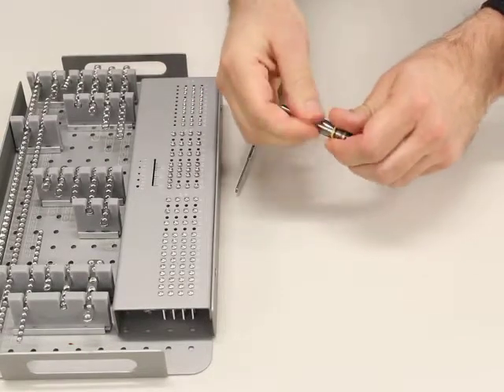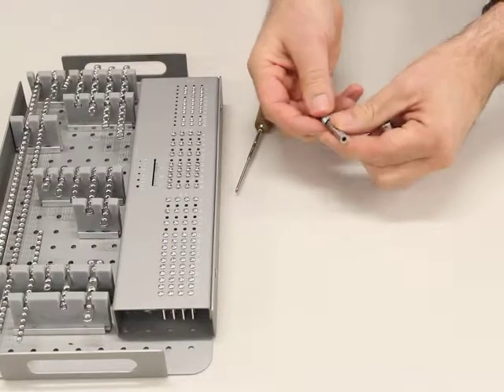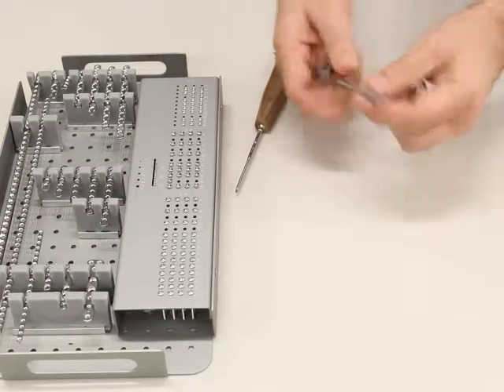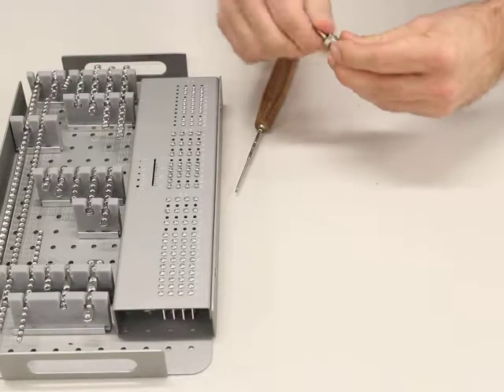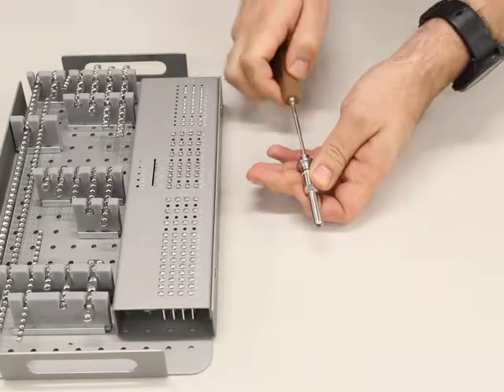To clean it, you just completely undo it and take the parts and give them a good clean. Then you put it back together and put it back on.